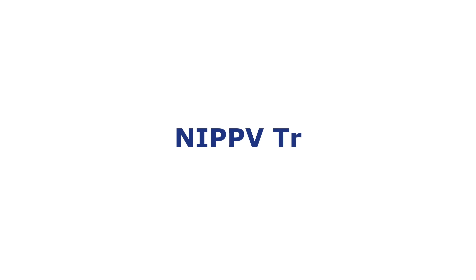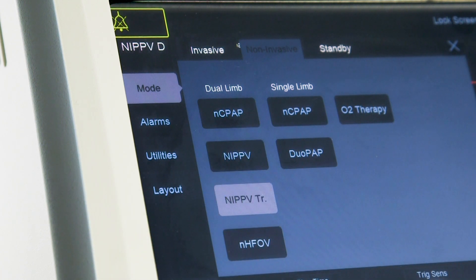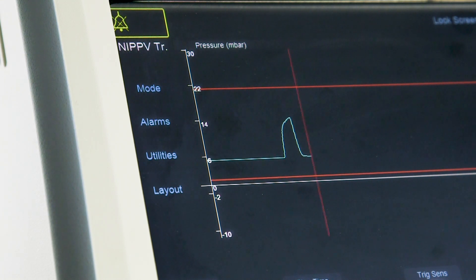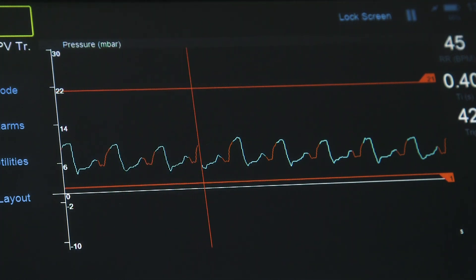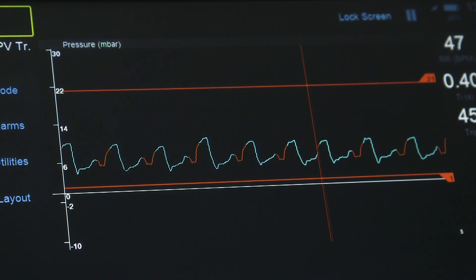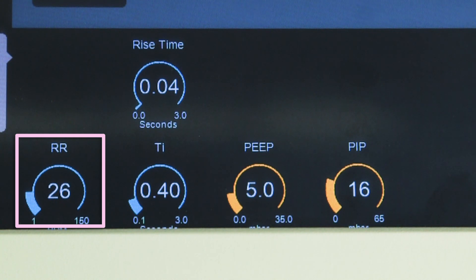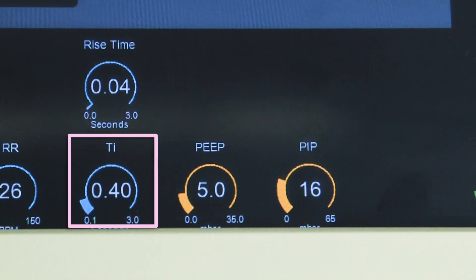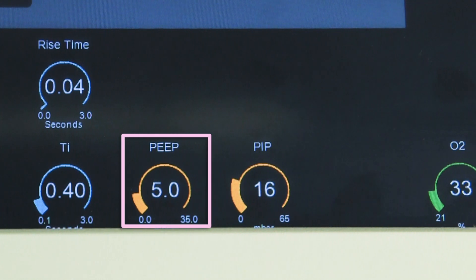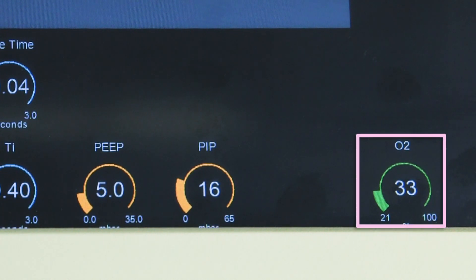Triggered dual limb NIPPV. Select mode, select NIPPV TR — triggered nasal intermittent positive pressure ventilation. In this mode the ventilator generates a continuous positive airway pressure at a level set by the user and provides support to each detected breath at a user-defined positive pressure. On the screen the user will set: respiration rate, which is the backup ventilation rate if infant breaths are not detected; inspiratory time, for ventilation and manual breaths; PEEP, positive end expired pressure; PIP, peak inspired pressure to be delivered; and O2 percentage oxygen to be delivered.